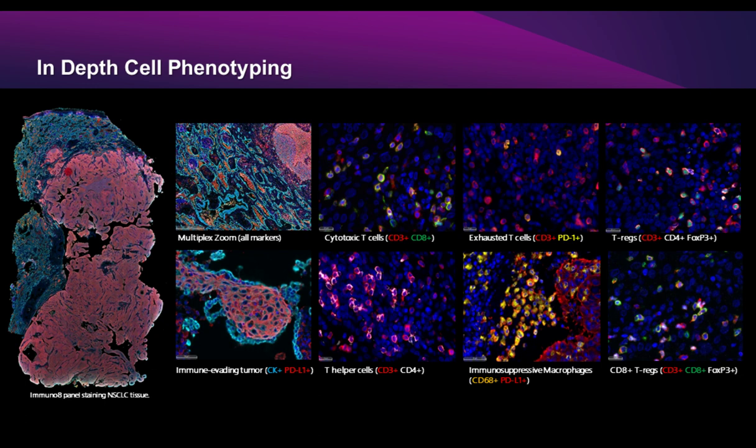Thank you. How long can we expect the fluorescence to be expressing on the slides and detectable? So that's another great question. Our fluorophores are incredibly stable. If you're using a good, fast whole slide scanner that minimizes photo bleaching and light exposure to the slide itself, we can get repeat scans of up to 100 acquisitions over a 6 to 12 month period without any problem.